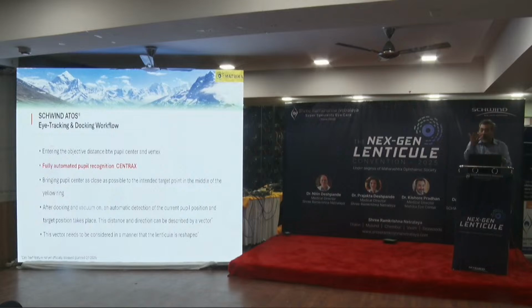So what happens with the whole pressure on the eye, and the suction and the resuction and all that, you're getting subconjunctival hemorrhages, and your intraocular pressure is getting very, very low with all the optical pressure. It's almost 200, 250 grams on the eye. You know, if you're taking it too long, the intraocular pressure goes very low, and your dissection becomes very tough.